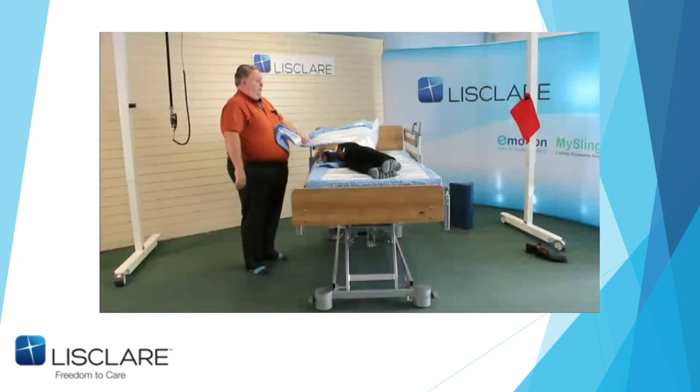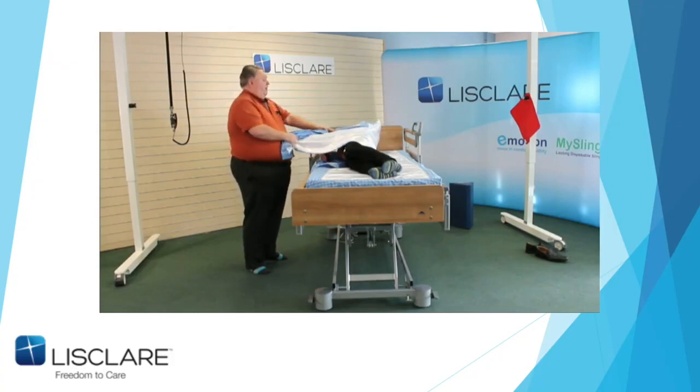Now again, that's not my size and weight doing it. Again, I probably should have brought my wedge with me to put it in over the top. But if there's another carer, this also protects them from getting hit. I haven't crossed the sheet over John's face to give him an access point. And you can see now you can lock that client in with ease.